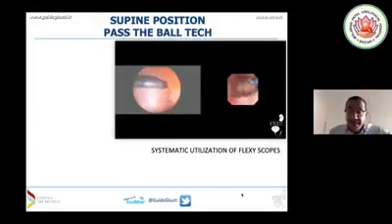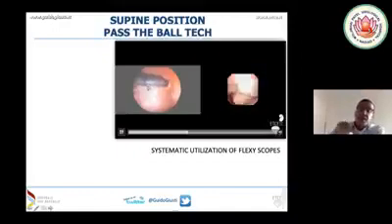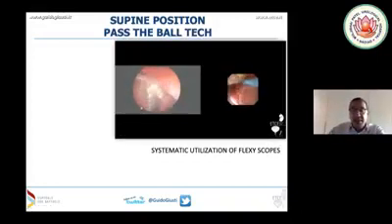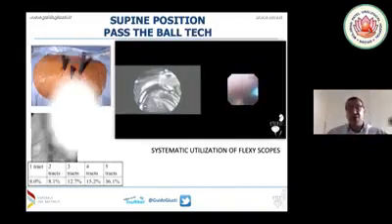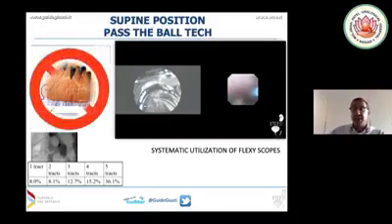As you can see, this is a real integration of flexible ureteroscopy going in a parallel calyx with nephroscopy. You see, this is pass the ball, or better, this is the stone, pass the stone. We are not talking about soccer. And as you can see in this case, my colleague Silvio Proietti was able to pass me the ball, so that we were able to render this patient stone-free without doing a second access. So multiple accesses actually are much, much less than in the past.